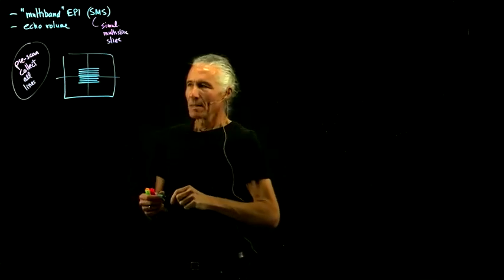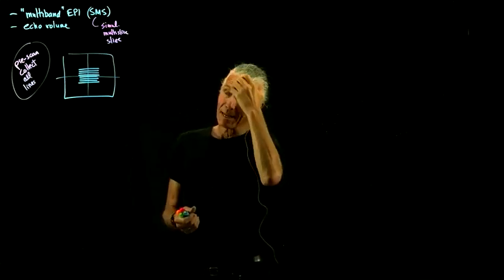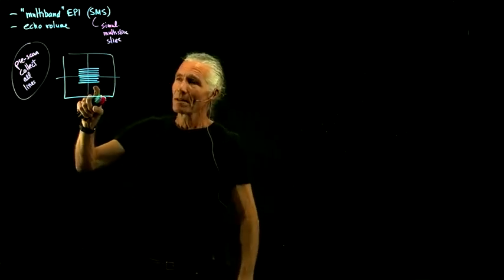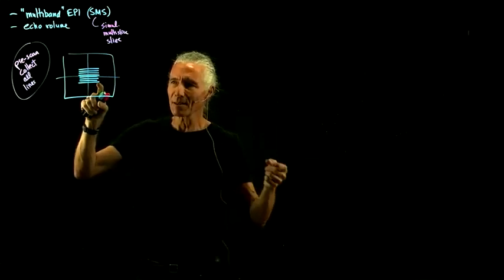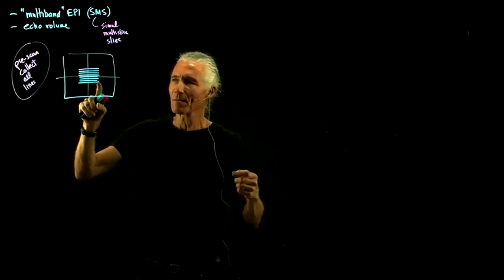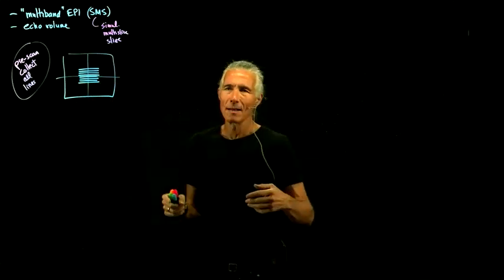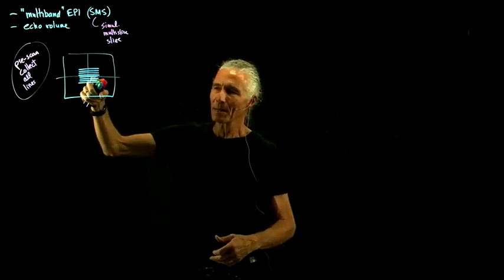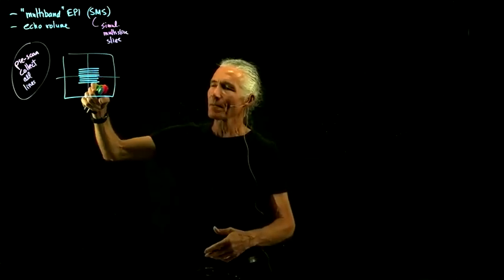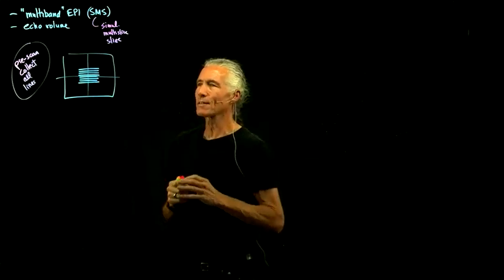And what was the theory for why we could possibly leave out k-space lines? Because remember, in our basic Fourier transform, every spatial frequency is orthogonal, equals uncorrelated, to every other spatial frequency. And so if we leave out a spatial frequency, we can't easily predict it from the other spatial frequencies because it's a completely uncorrelated, orthogonal signal.